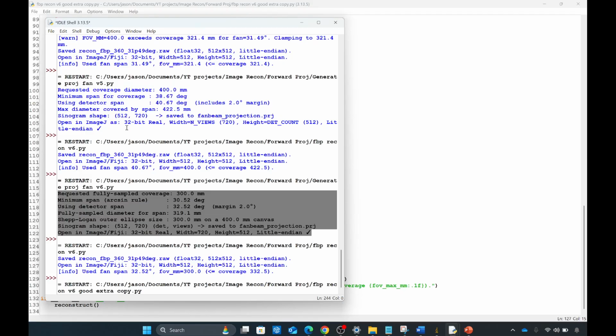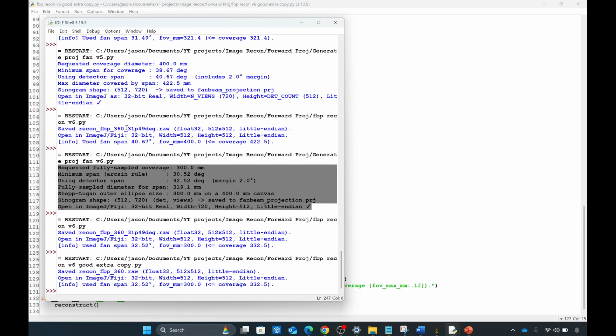It will take a minute. This 2D filtered backprojection runs just fine on the CPU, and it's great for demonstration. But in real 3D cone beam CT, the problem explodes. We are talking hundreds of millions of voxels and thousands of projections. Doing that with nested loops on the CPU would take hours. That's why all practical 3D CT reconstruction is GPU accelerated.